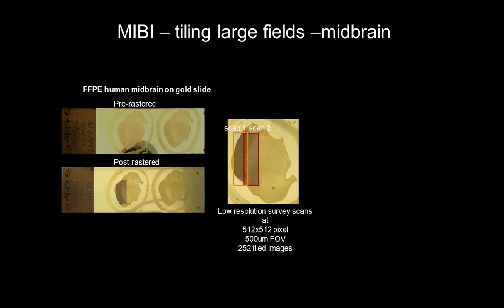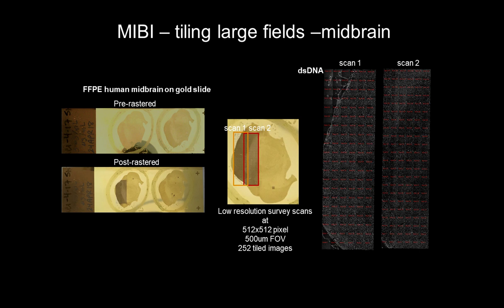Just to orient you with what we're going to be looking at, we can look at these scans in terms of the restitched images. So much like we did for the tumor sample previously, the way this works is we image a whole bunch of 500 micron tiles, and so we queue these tiles up such that the 500 micron tiles are roughly 500 pixels by 500 pixels, so you're dealing with a resolution of about 1 micron.